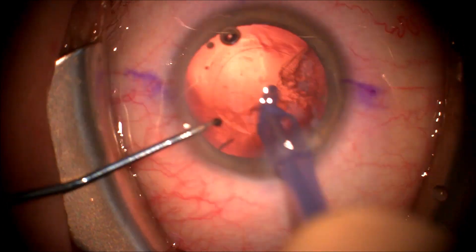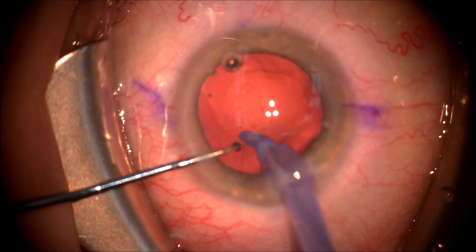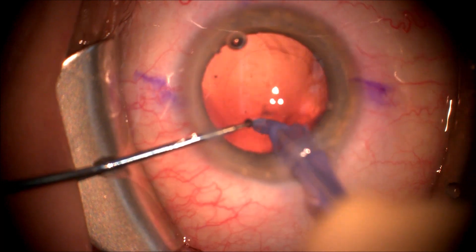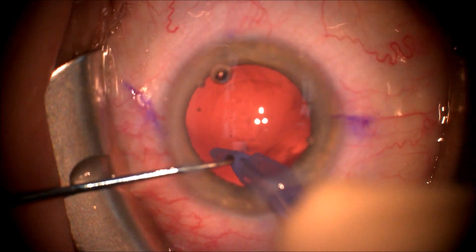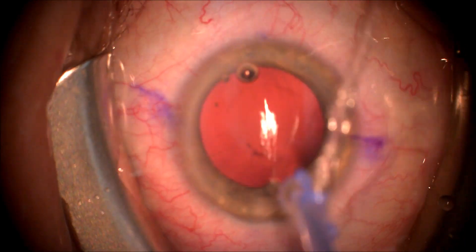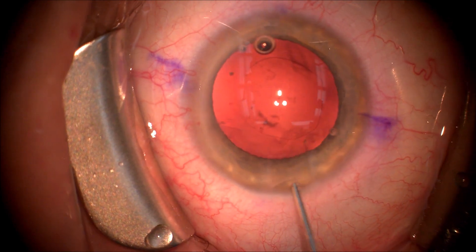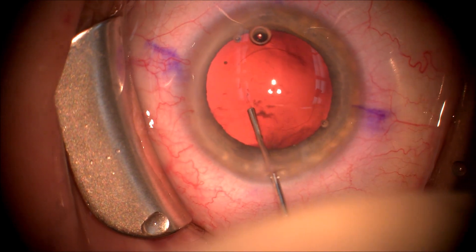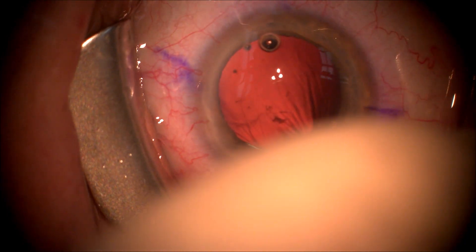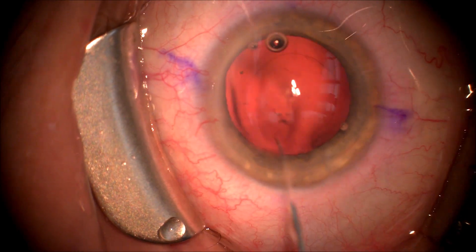We're going to remove the cortical material with irrigation aspiration using an automated irrigation aspiration handpiece. You can see the cortex very quickly removes from the eye. It's important to try to get all the peripheral cortex, and as you can see we are removing some capsular fornices cortex that was sub-incisional.